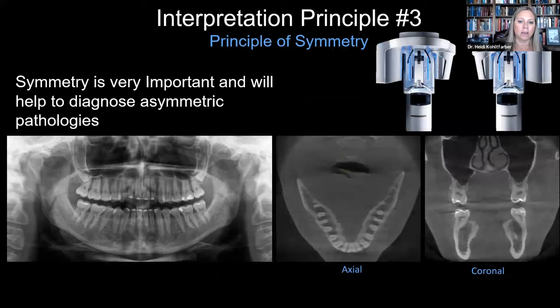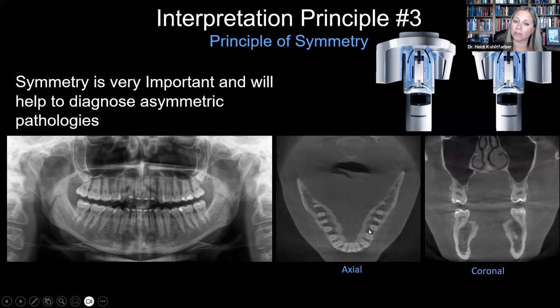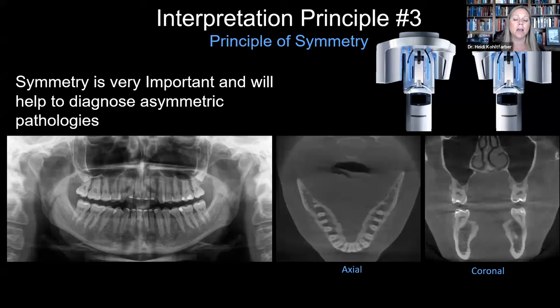The principle of symmetry is huge, and when you're just starting out, it is extremely helpful. You can always compare one side to the other. If this side looks very similar to that side, I know it's normal. So in case you cannot remember all your anatomy from dental school, we want to reorient the patient so we can use symmetry — going down through in the axial as well as in our coronal sections.